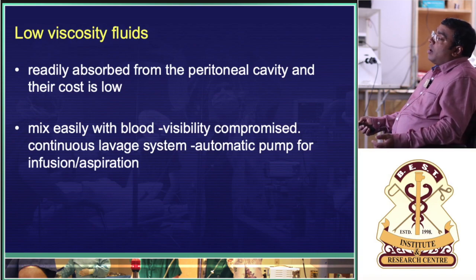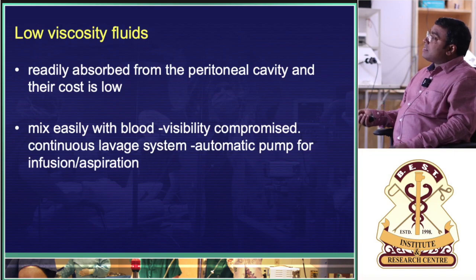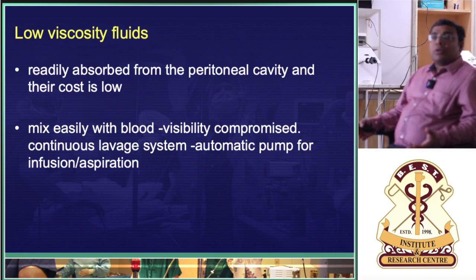Next, the drawback is, as I said, it easily mixes with blood. Hence, visibility is compromised. Hence, a continuous lavage system is required. So, for continuous lavage, you will have to have an outflow sheath also. Not just an inflow, but an outflow sheath.